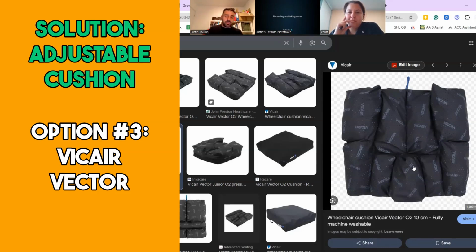And she had a pressure injury before, so we really wanted to maintain a really high level of pressure care. And so this cushion was a good fit. She was also incontinent. She was quite wide and had multiple carers. And so the good thing about this cushion as well is that it's pretty low maintenance.